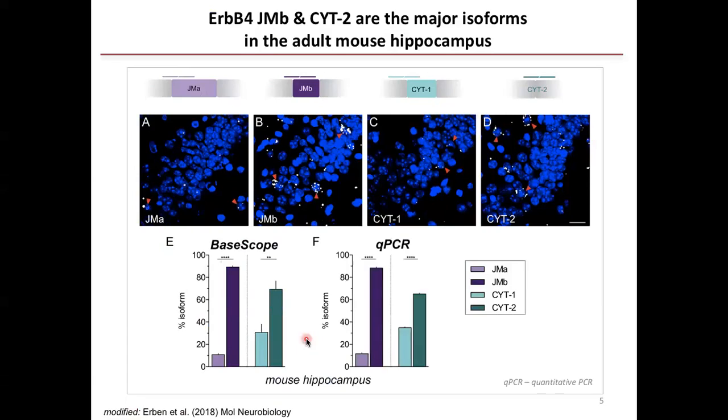Since BaseScope is only considered a semi-quantitative approach, we compared these results with the more conventional quantitative method of TaqMan quantitative PCR from isolated RNA. And it was very encouraging to see that these results are similar.